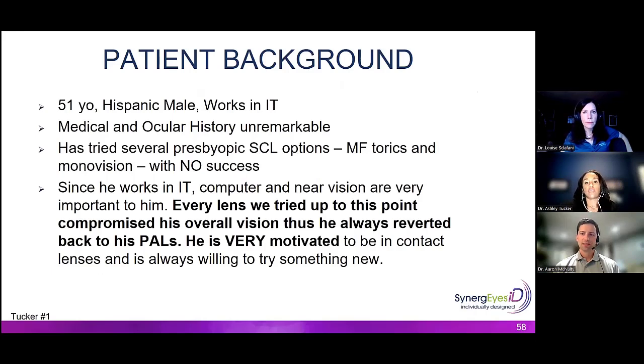His primary job is working in IT. He does a lot of side things. He works with children a lot, doing a lot of tutoring, but IT work is what he does the majority of the day. He was a patient of mine who basically we tried everything. He was so motivated to be in contact lenses. So we tried every soft contact lens option we could, multifocal torics, and of course, monovision, but with no success because of his working distance, needing within arm's reach to be very, very clear and no compromise there.